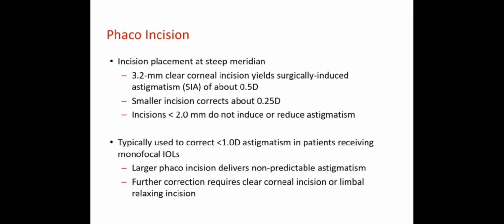So don't be surprised if some of your surgeons, even if they are doing 2.2 millimeter incisions, have a slightly different induced astigmatism value. Okay.